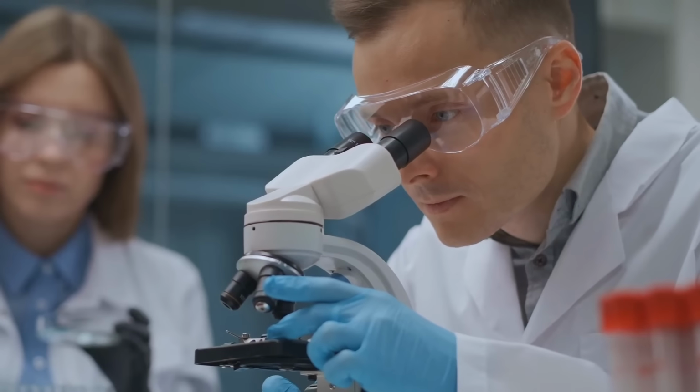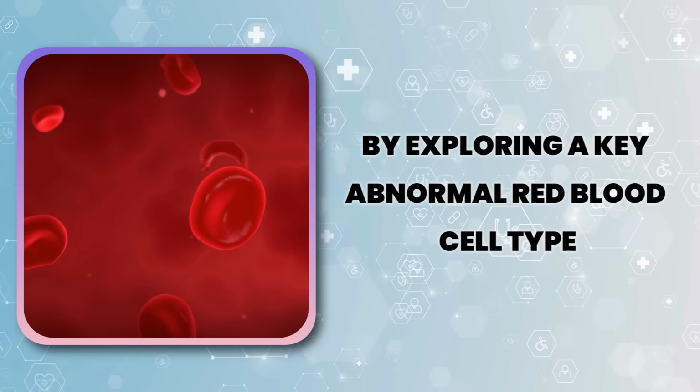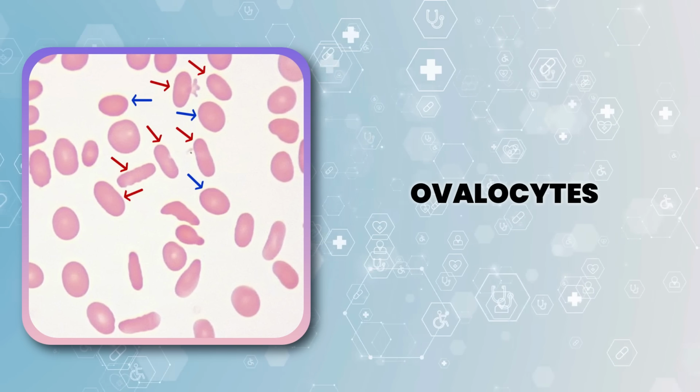In this video, we continue our hematology series by exploring a key abnormal red blood cell type, ovalocytes.